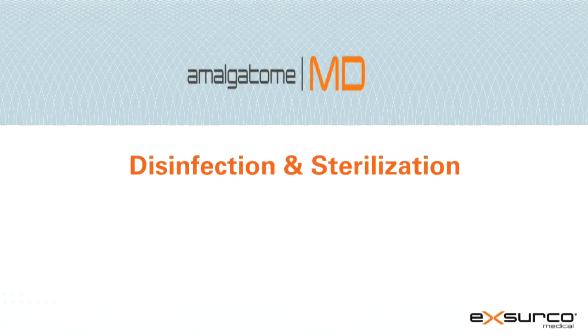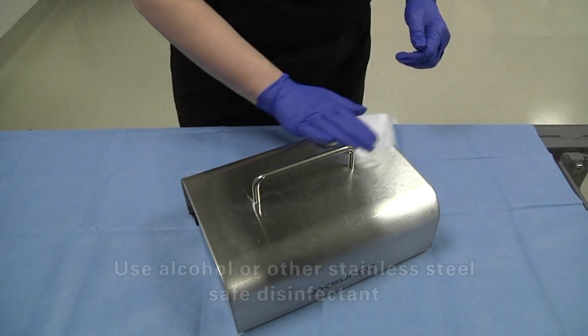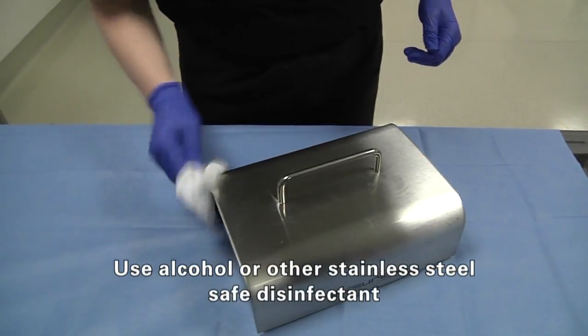Disinfection and sterilization. Disinfection of the power supply: wipe down the power supply and cord with alcohol or other stainless steel safe disinfectant.